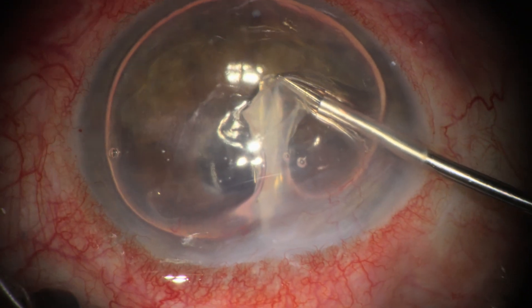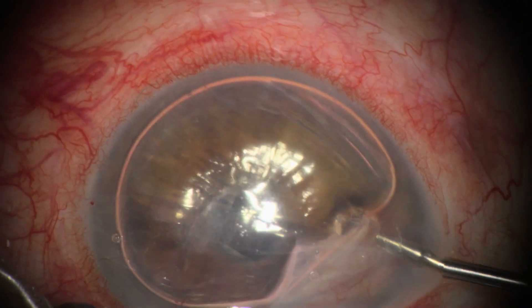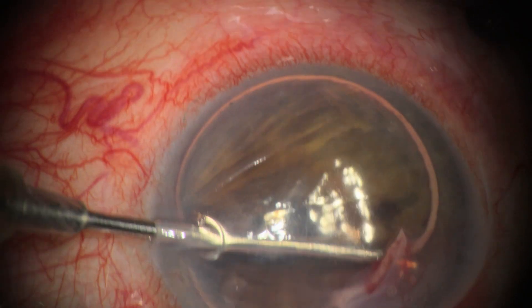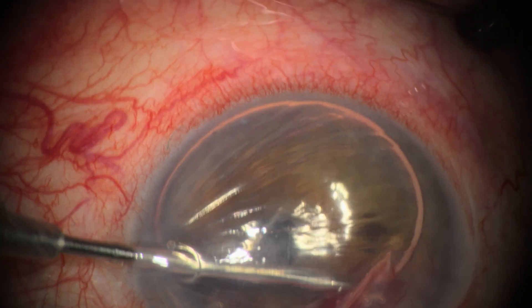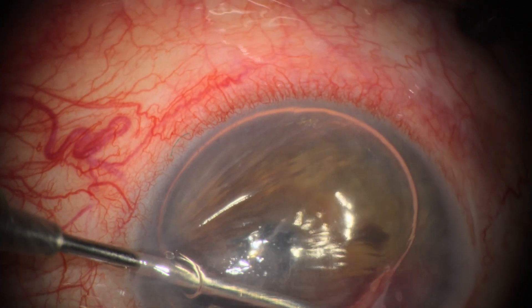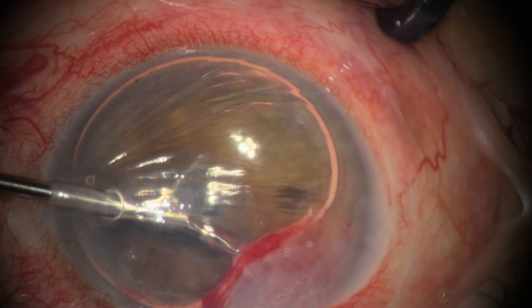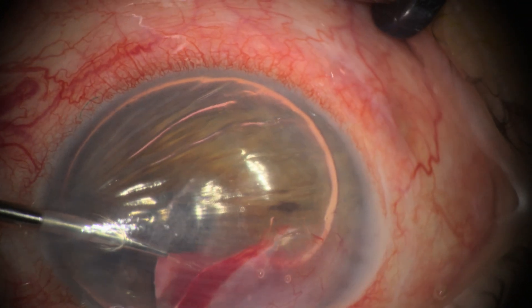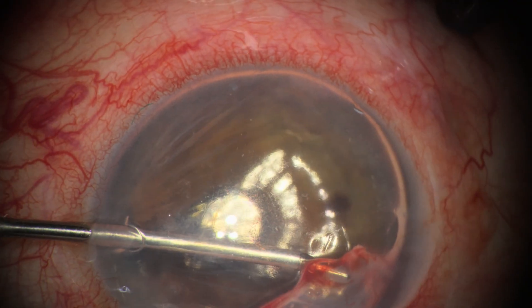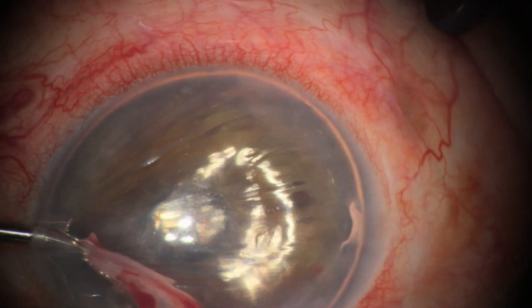Reviewing the literature before surgery, we found some reports that did not advocate for complete removal of the membrane, but rather just peeling it off the cornea and allowing it to curl back into the angle. However, we felt that the membrane was quite large and that removing it made more sense — though time will tell if this was the correct decision for this case.